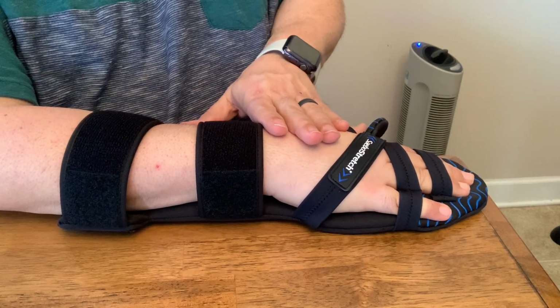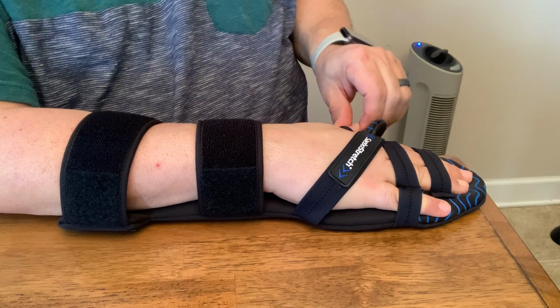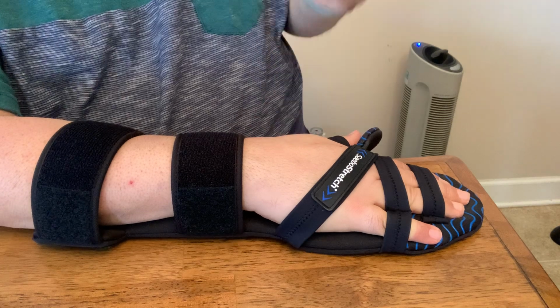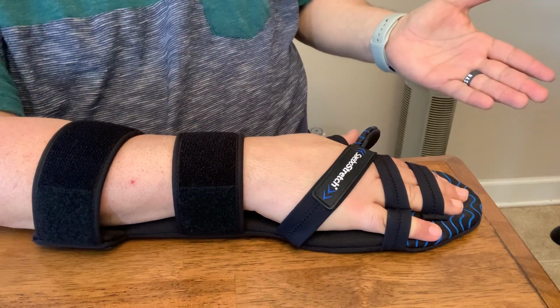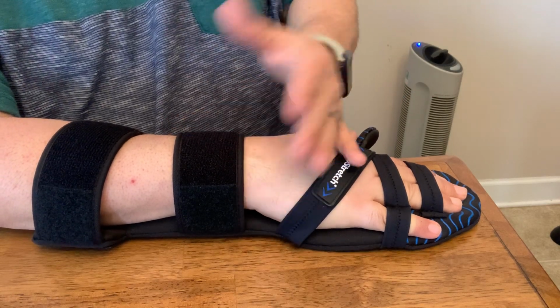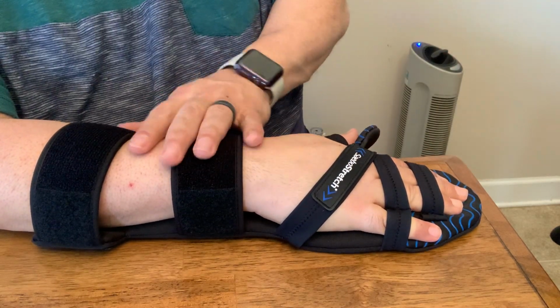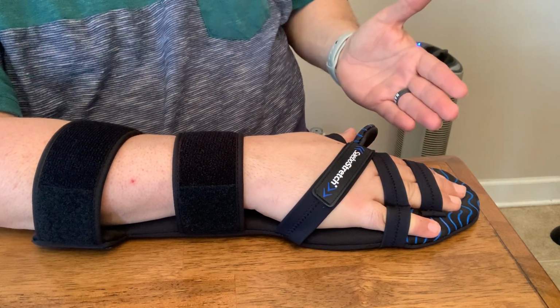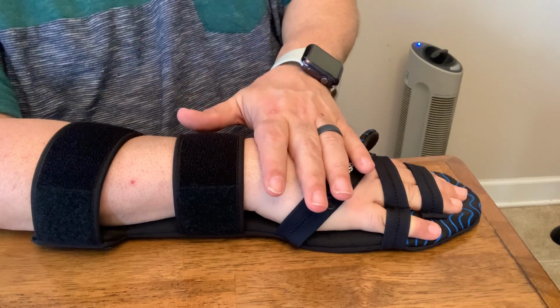And I have to tell you guys, I finally learned how to do it. Because if I have to go to the bathroom, I have to take this off. You know what? I can't pull up my pants. I can't do a lot of things. So you remove this, you go to the restroom, you come back, you reapply everything, and that's how you do it. All right?